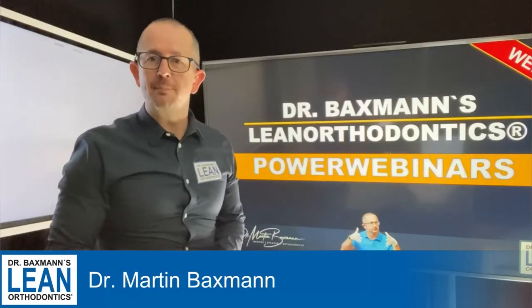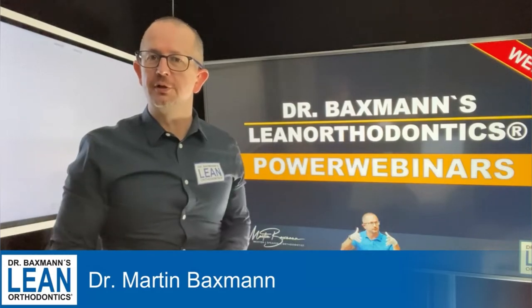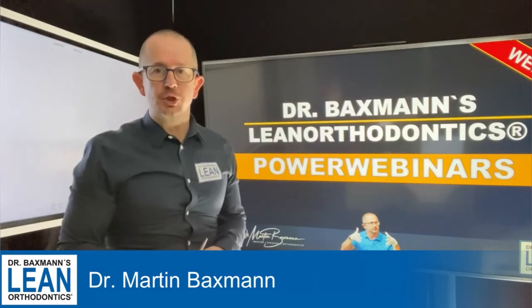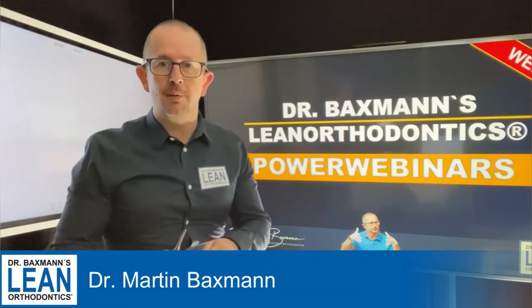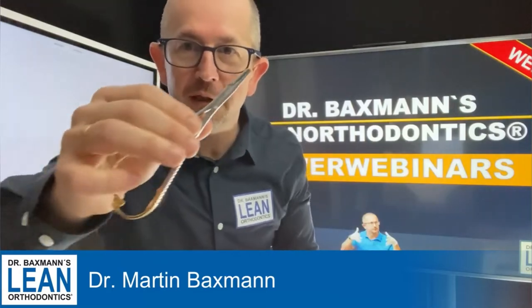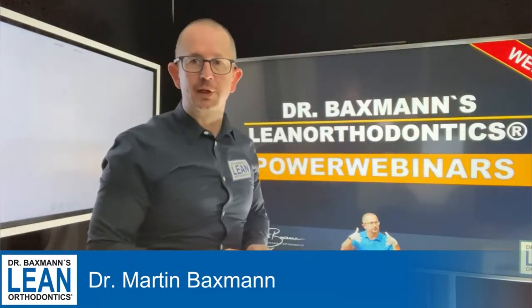Hey guys, welcome to my Power Webinar series in lean orthodontics. My name is Dr. Martin Baxman, and today I'll show you how to fit a power chain like this with a needle holder — very easily and quickly.